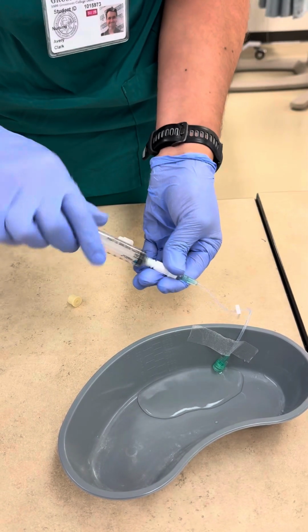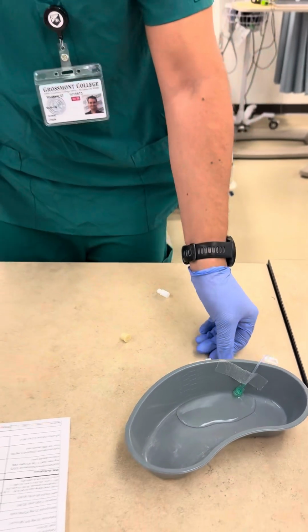All right. We are done with that. The medication has been administered.